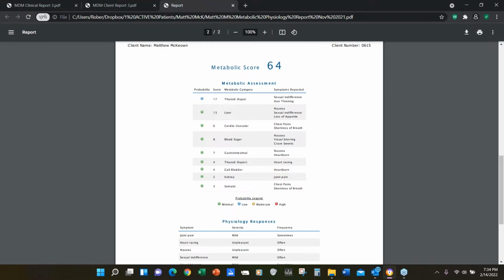And what number would you consider 1 standard deviation, for example? It's from about the mean, or from the norm? The mean is around 78. So it's roughly 150. Okay, so double that. 150, say, or under, you're okay with that for people? I wouldn't say I was okay. I would just say that it's going to minimally interfere. Okay. Over 150, it's going to interfere more.